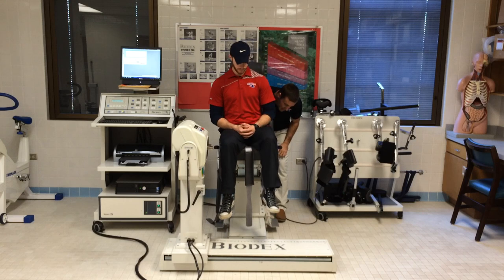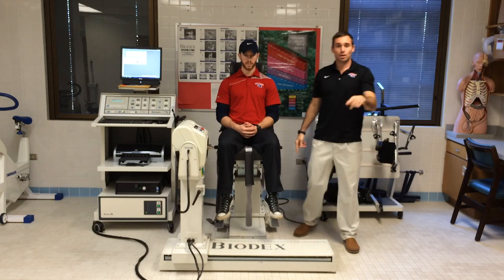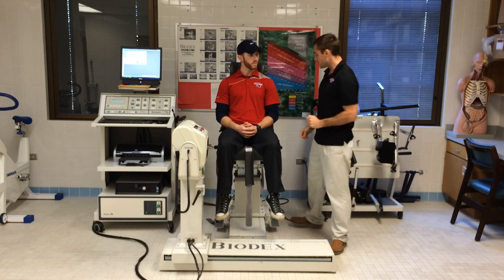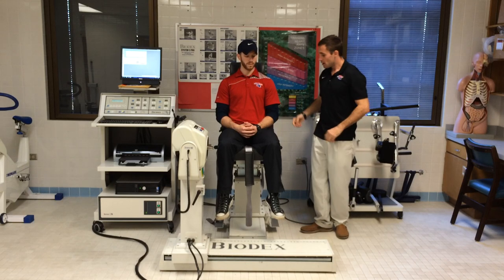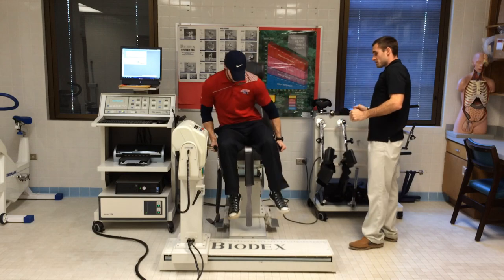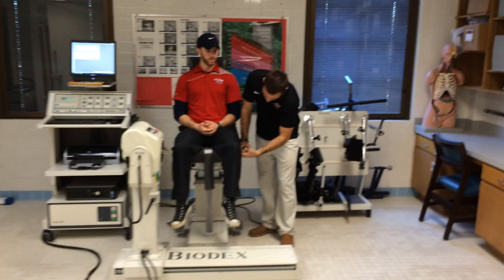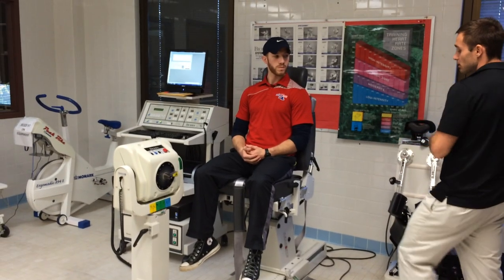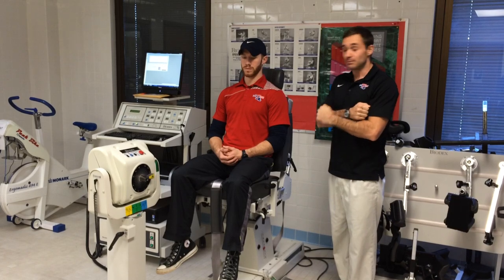The way I'm doing this is there's a circular handle right on the back of the chair. Turning it one way will move the chair backwards, and turning it the other way will move it forward. It's really easy to find. Just a handle that circles around. So readjust yourself. Let's make sure that your hips are pulled all the way back. Again, I'm taking 2 fingers right behind the back of the leg. Now I have space, so he has the ability to go through the full extension and flexion when we do the test. Now that we have this set, I want to get him strapped in.